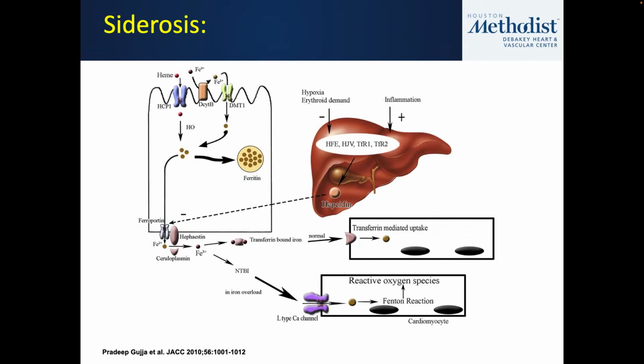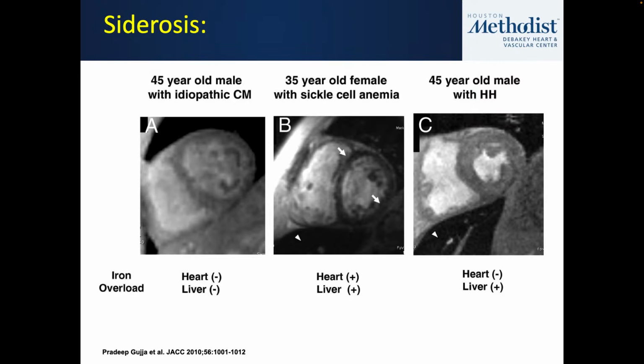Let's look at another condition here, and this is iron overload. Over the last, I would say, 25 years or so, there's been a wealth of data highlighting the role of cardiac MRI in assessment of iron overload within the myocardium. And here are just 3 example cases.